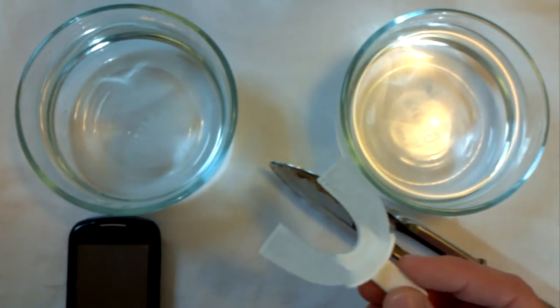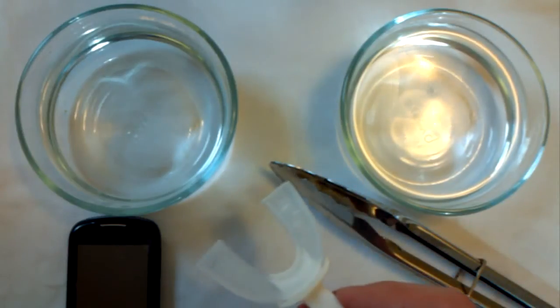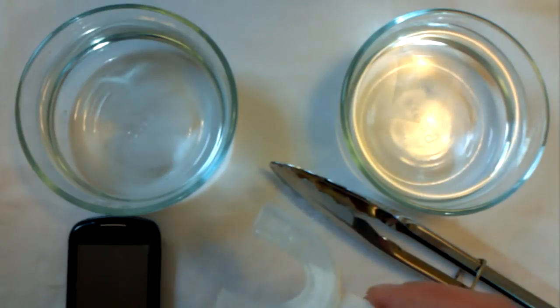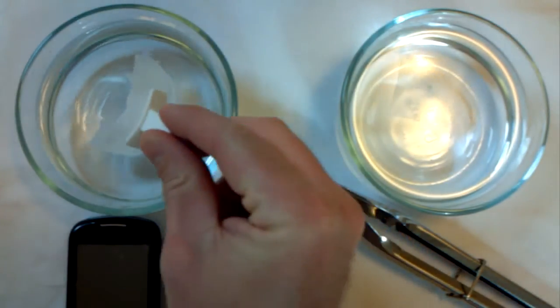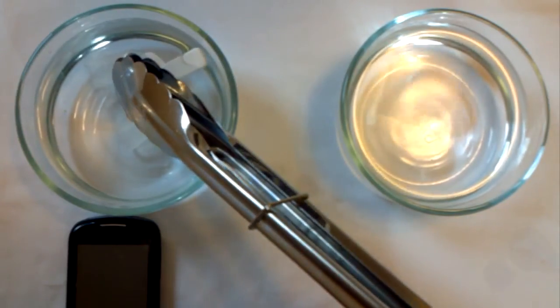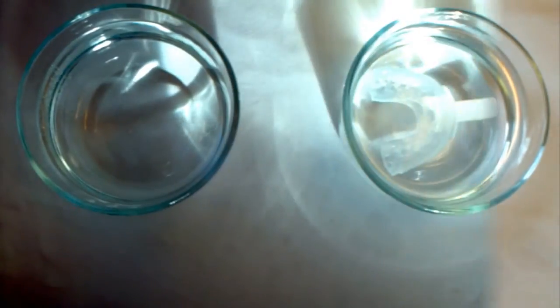So I'm going to go ahead and get this process started. I'm going to drop it in the hot water, and I'm going to get back with you here and let you know how it went for me. So let's drop it in. You can see it wants to float. So you're going to kind of hold it down with your tongs. You don't want to distort it. And start the stopwatch.